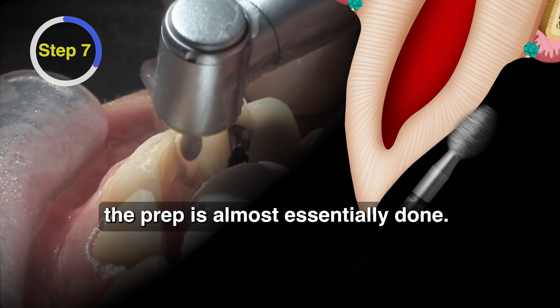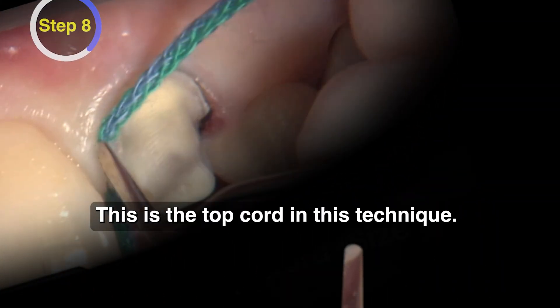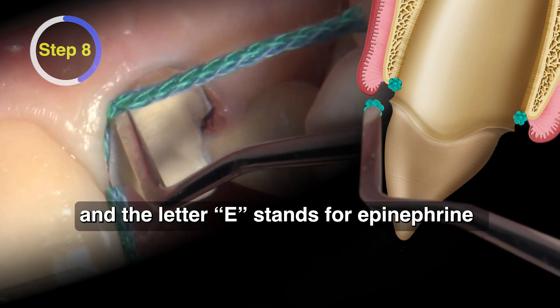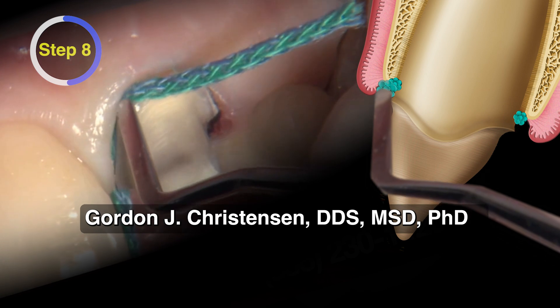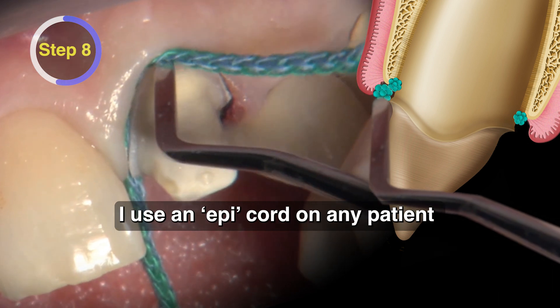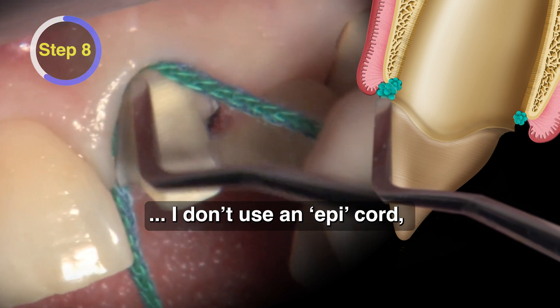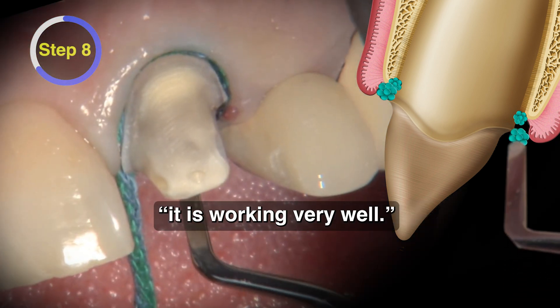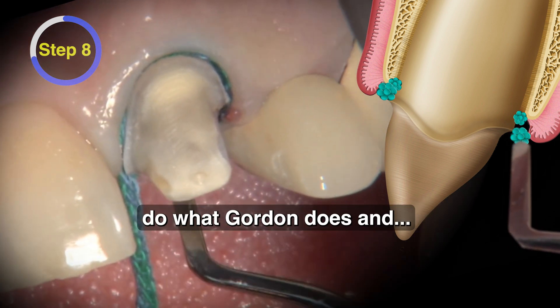After that's done, the prep is essentially done — we have one more step after we pack this cord. This is the top cord in this technique, a size two cord — it's actually a 2E cord from Ultradent, and the E stands for epinephrine. I started using an epi cord like this when I heard Gordon Christensen talk about it, probably 15 years ago. I said I heard they weren't safe, and he said his rationale is to use an epi cord on any patient who can tolerate epinephrine in the local anesthetic injection, and if they can't, use a plain cord. In his 40 years of being a prosthodontist, it was working very well. So I adopted that same philosophy.